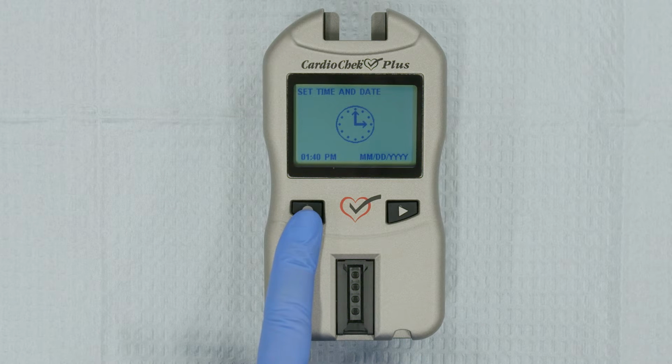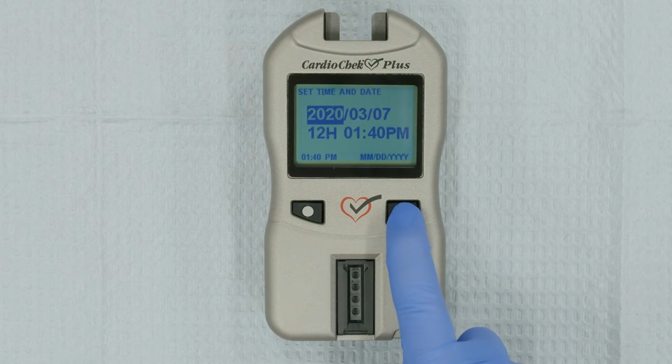After setting the language, set time and date will be displayed on your screen. Press Enter. Using the Enter and Next buttons, set the correct date and time on the analyzer. Before running patient tests, verify that the analyzer's electronic and optical systems are working properly by running a check strip verification. You'll use the gray check strips included in your carrying case.